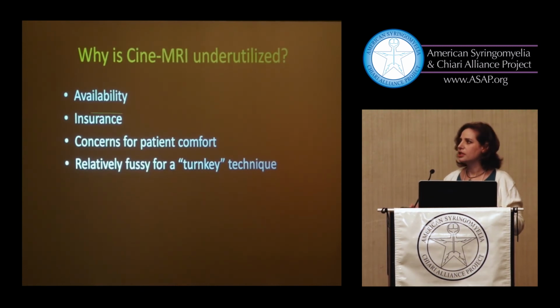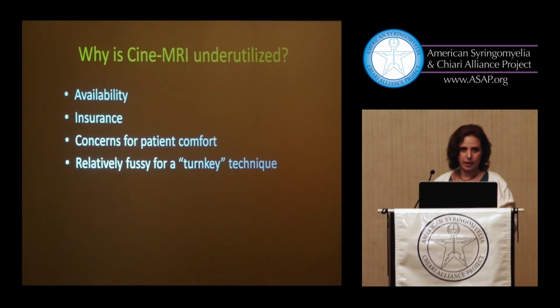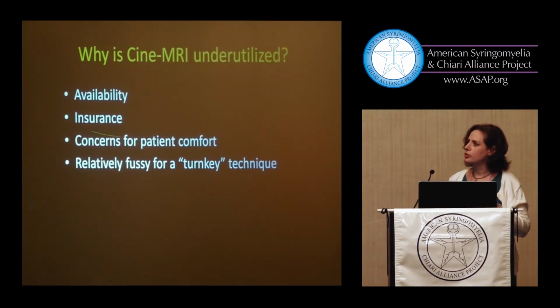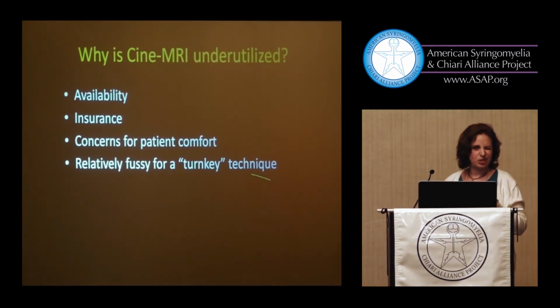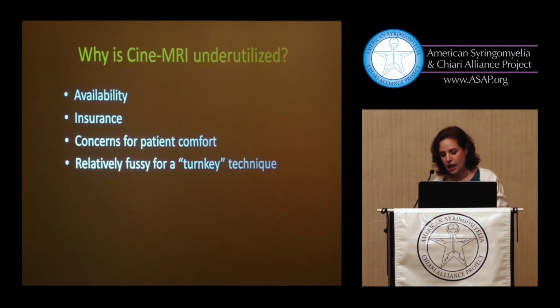I think there are sometimes concerns for patient comfort, which I'm going to address in a moment, because for many of you, you may be worried, what are they going to do to me? I'm going to tell you what we do to you. It's not bad. And I think this is the real problem, is that all the stuff I told you about that encoding velocity and having to get someone to put in a number, ooh, it's scary. It is. It's intimidating. And I'm going to talk about that, and I think that's the real problem here.